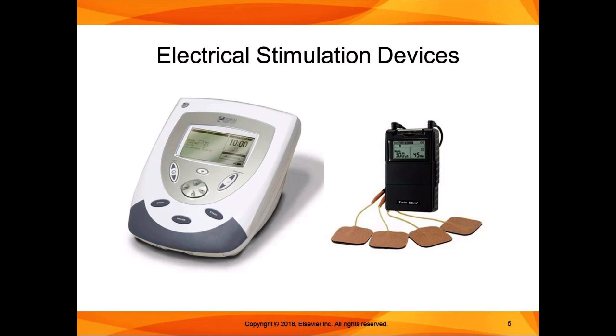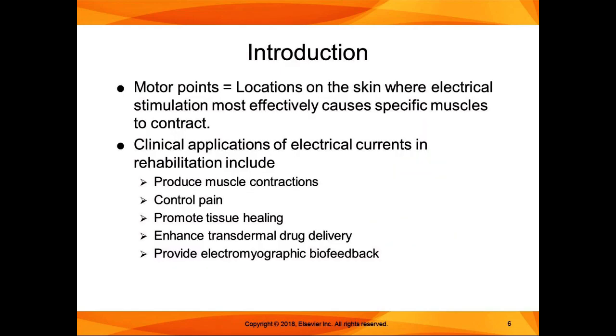The unit on the left there is something more like what we'd see in the clinic for electrical stim, and we will have things like that in the lab, both TENS and the other units for you to practice with.